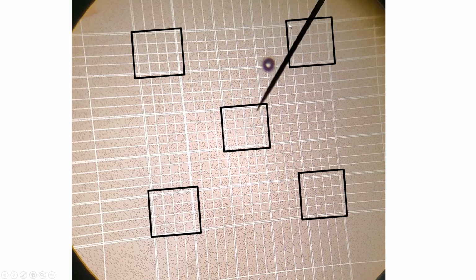These are just arbitrarily named boxes 1, 2, 3, 4, and 5. So you're responsible for counting the number of red blood cells in each of these boxes. The first thing you'll notice is that when you look at any one of these boxes, that one box is actually divided up into 16 little boxes. So you still have quite a bit of counting to do even in one box.